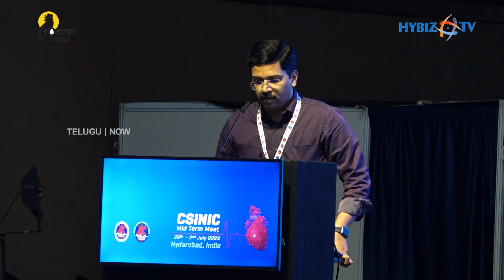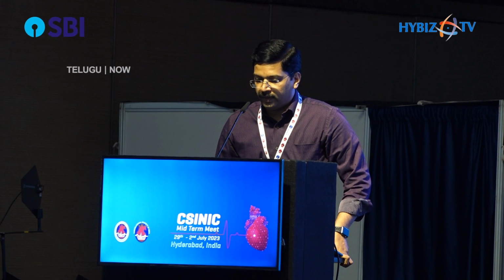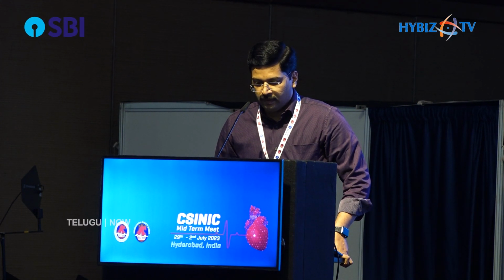Predilated the LCX with 2.5 followed by a 3 millimeter cutting balloon, and we kept the LCX stent, and a 3.5 millimeter balloon in the LAD. And the LCX stent was deployed, and the side branch was optimized using the stent balloon, and the first crushing was done using the same balloon, and the proximal crush was done using a 4 millimeter balloon. Then the first recrossing was done through a non-distal strut, then the side branch ostium was opened, then the first kissing balloon dilatation was done using a 3.5 millimeter balloon in both vessels.